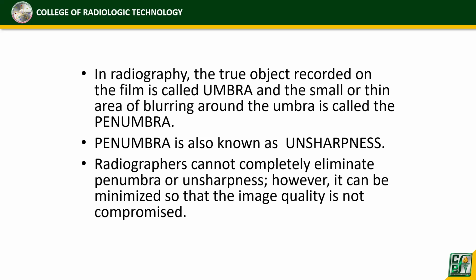Penumbra is the blurring around the umbra. So radiographers cannot completely eliminate penumbra. However, it can be minimized so that the image quality is not compromised. So katulad na sinabi ko sa inyo kanina, na yung mga inherent factors na yan, hindi natin yan ma-eliminate. But instead, we can either avoid in some instances or minimize those inherent factors.